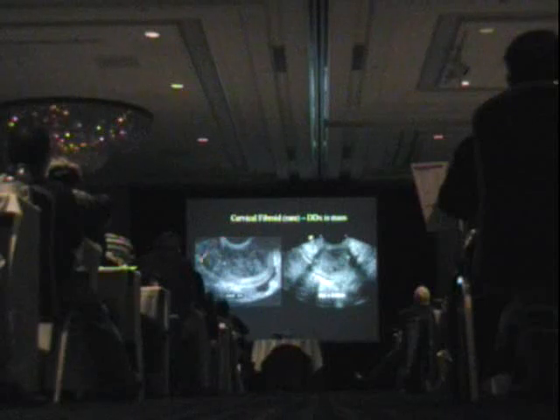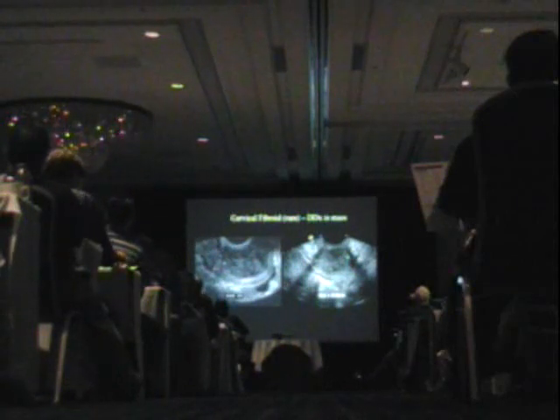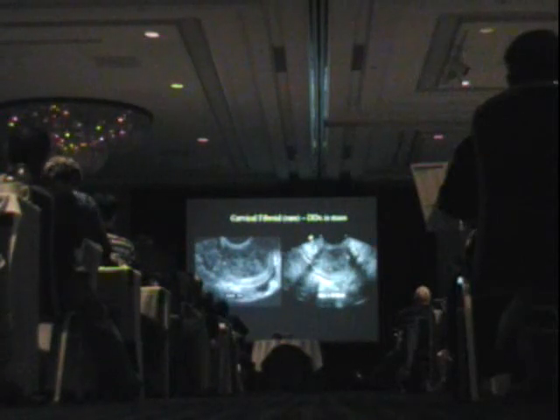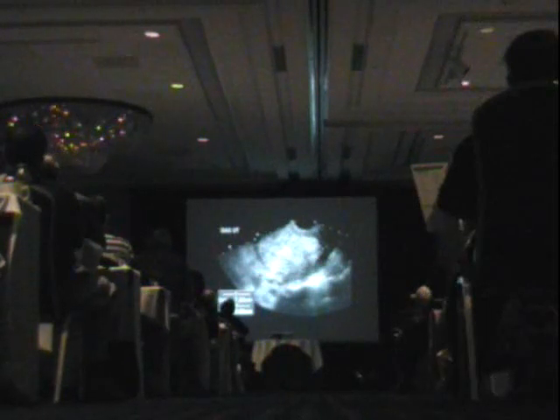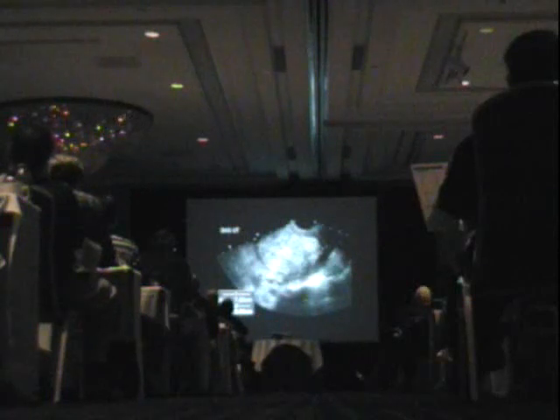Sometimes the fibroids can be located in unusual locations. Here is a fibroid that is growing right in the middle of the cervical canal. You can see it coronally here. Now, of course, the differential for something like this would be cervical cancer in the canal. But the office called down and they could see this fibroid prolapsing through the cervix. So we were comfortable that this was a fibroid in this instance. Sometimes fibroids have atypical sonographic characteristics. In this instance, the fibroid is extremely echogenic, and this is a lipoleiomyoma, where there's a fatty composition to the fibroid as well.